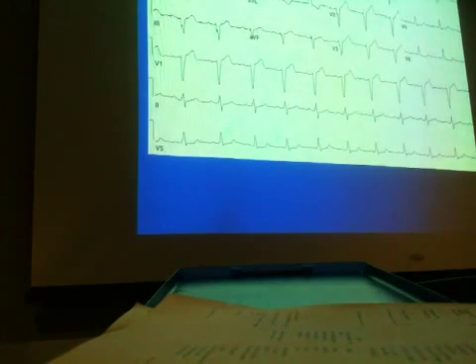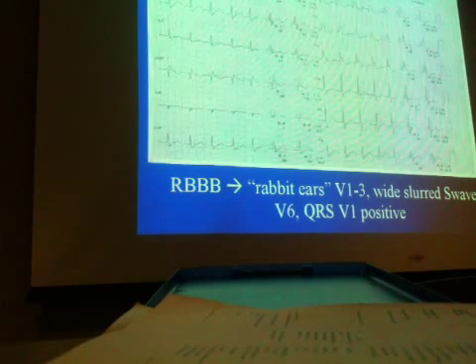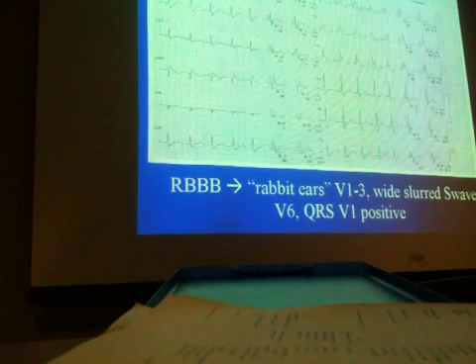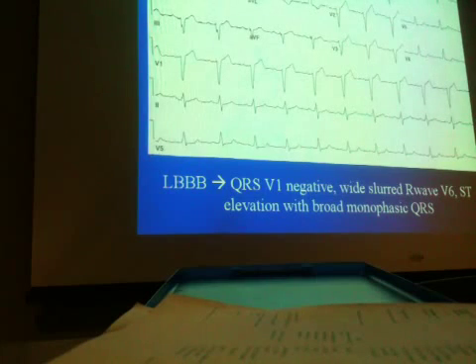This is the opposite from this. See everything, here we have the R wave, nice R wave going up, and if we're lucky, we truly see the rabbit ears. Here we have left bundle. And remember how I said, it's mostly negative? See how most of it is actually below the isoelectric line. You have a really big, deep S wave. Because it's opposite from right bundle, you would expect there to be a big S wave instead of an R wave in V1.